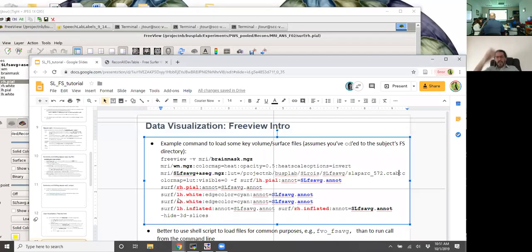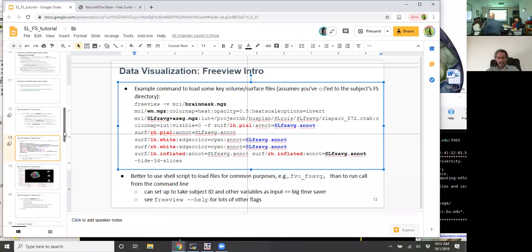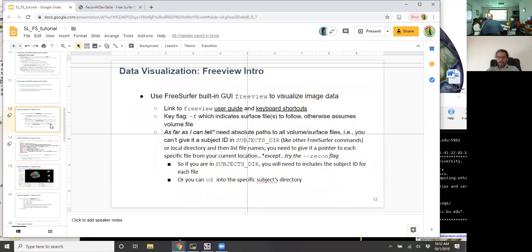So you probably said this and I missed it, but when you have one of these MGZ files containing the parcellation for a given subject, is there a way to know which annotation file was used to generate it? Not directly, no. The way that we are moving here is that the user responsibly assigns it a label that makes sense.